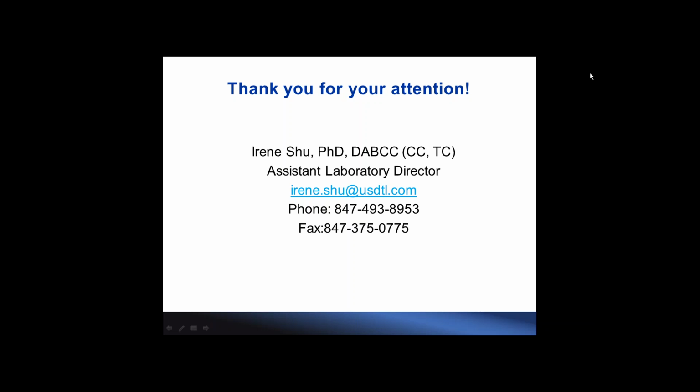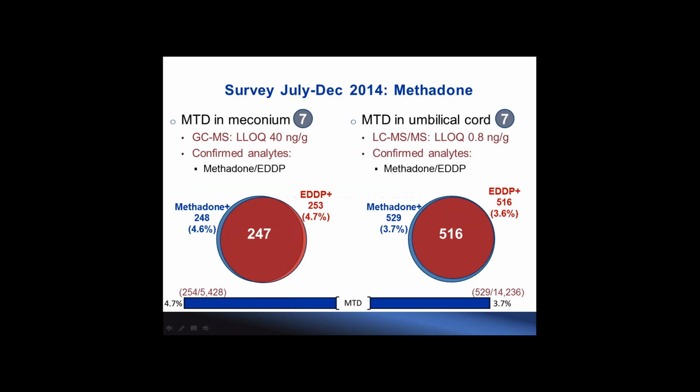There is a clear instruction how to keep it forensically correct when the sample is sent and how we receive the samples. I'll add an addition as well. Because we are forensic, we follow the strict chain of custody, and that's a big difference in our collection instructions with our collection supplies, is that it is a forensic collection. So that's why we have our specific collection instructions.